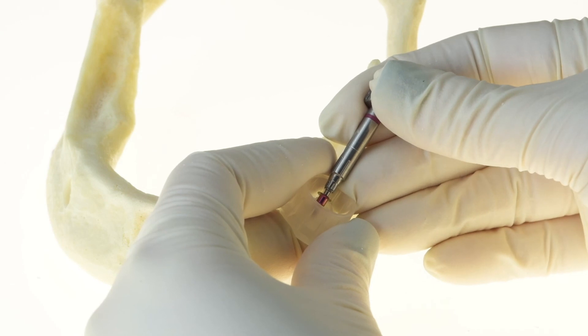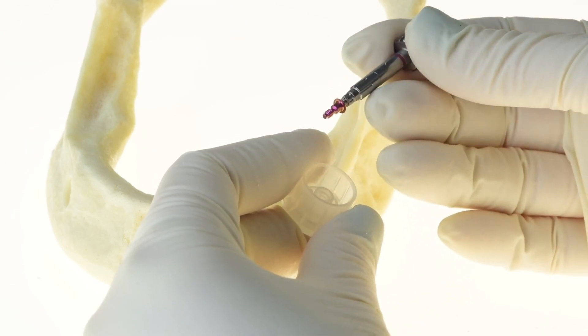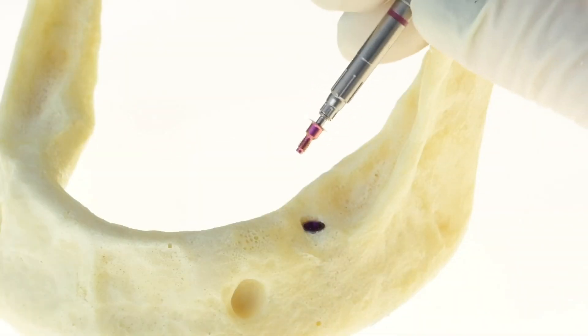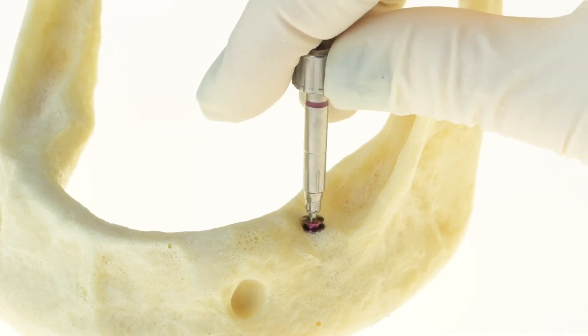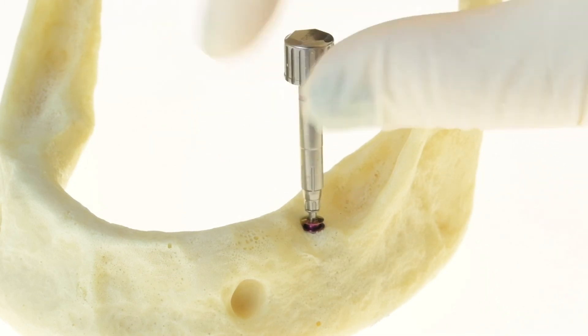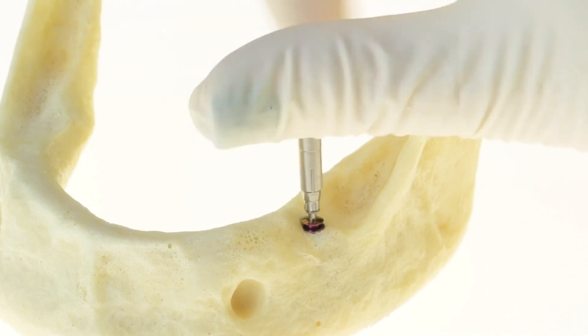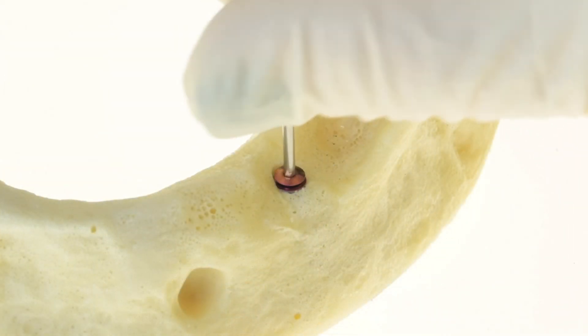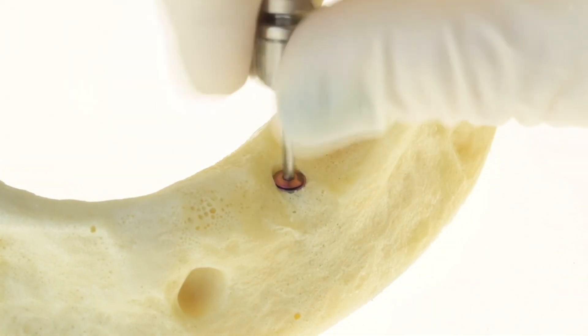After placement of the implant, use the insertion tool to remove the cover screw from the packaging and place it into the implant. To complete the procedure, use a screwdriver to tighten the cover screw onto the implant.